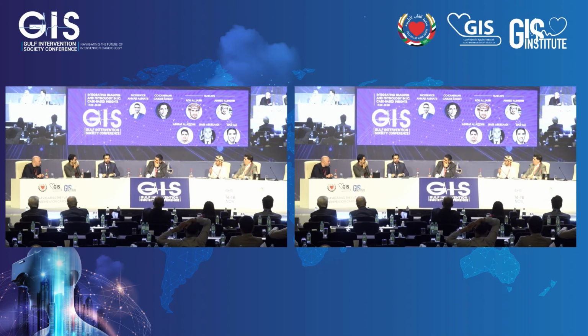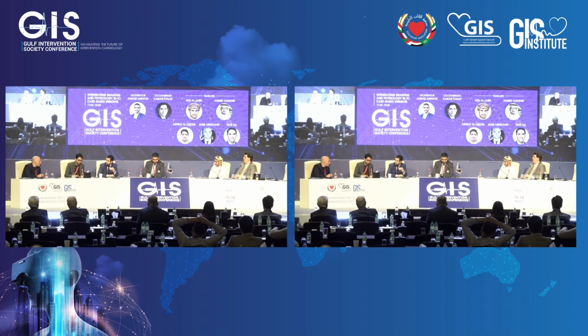So that's very nice. And what you're referring to is a new way to measure blood flow in the coronaries. It's called absolute flow. You need to have something called the ray flow infusion catheter, and you can measure absolute flow in milliliters per minute and absolute resistance in Woods units. This is completely new.